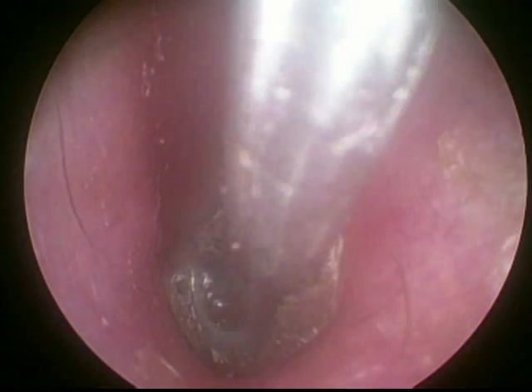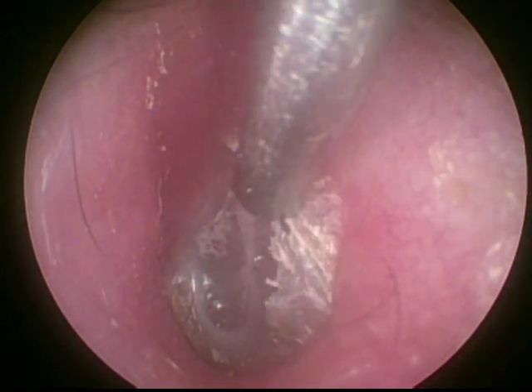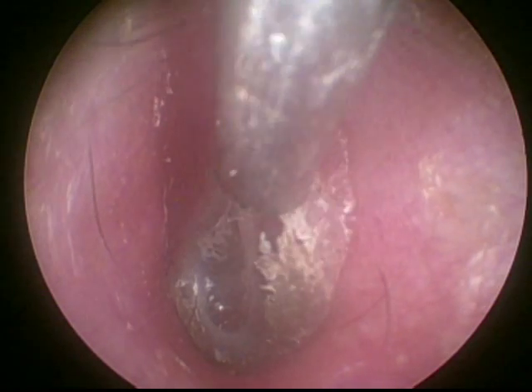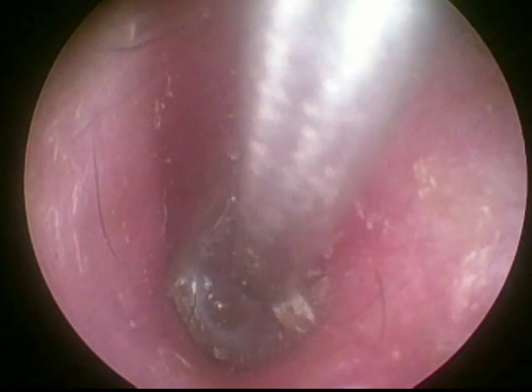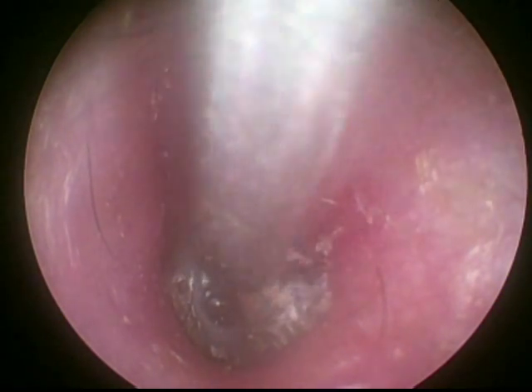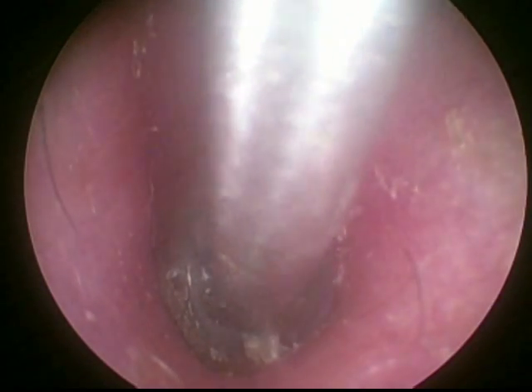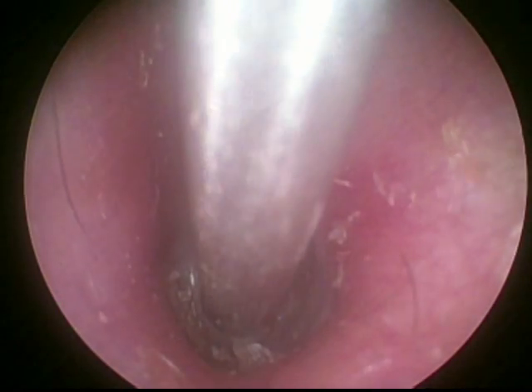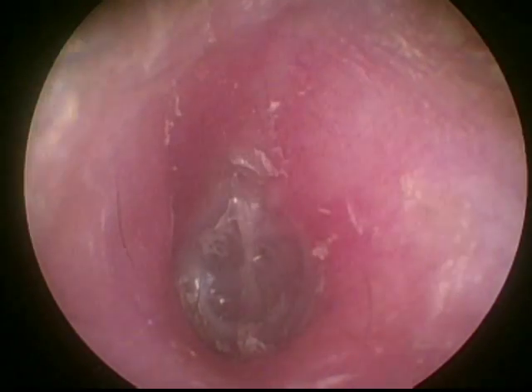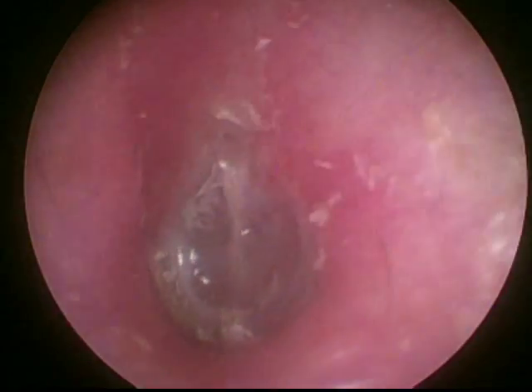Sometimes we can find this squamous epithelium is sticking to the canal wall, and when we do suction cleaning, it peels off like this. This is the beauty of the external auditory canal — this lateral migration property of skin and epithelial shedding helps in cleaning the canal. In cases of mastoid cavity, we get a clean cavity if we preserve this skin.